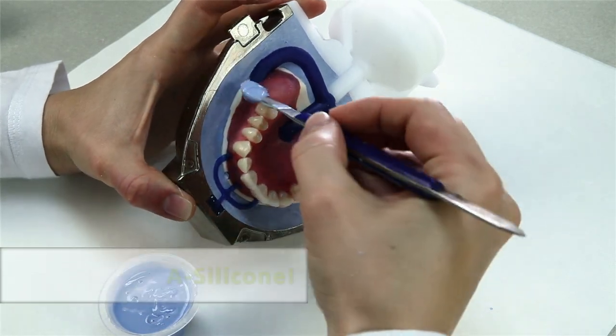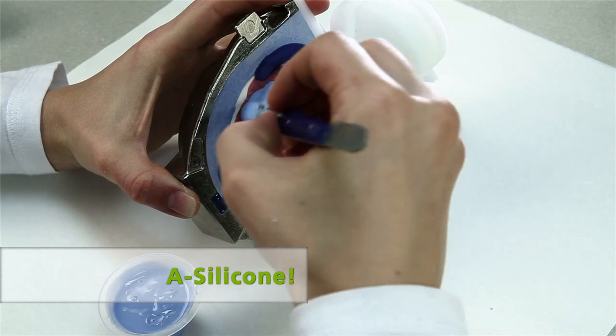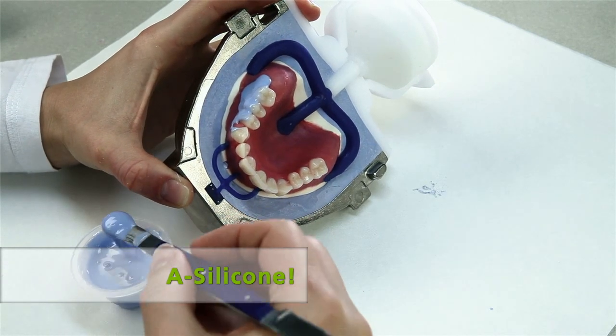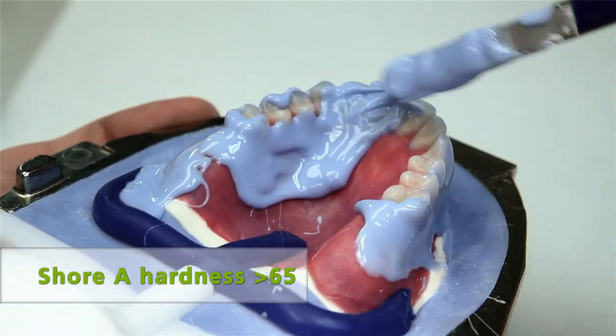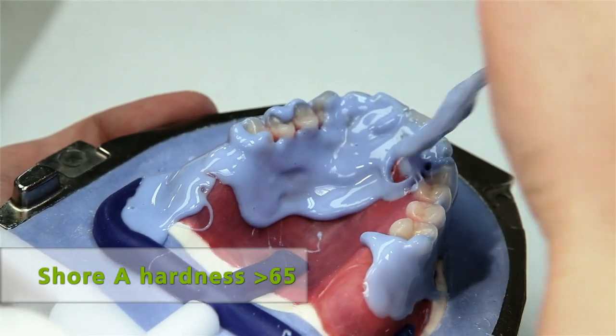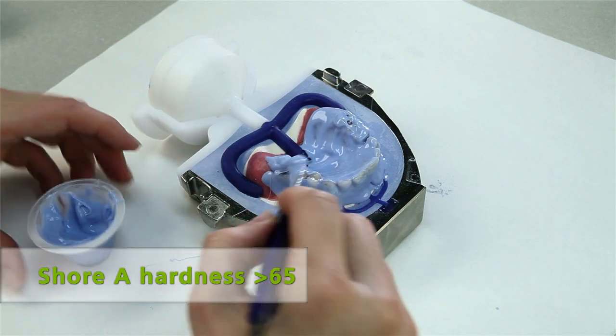Cover the teeth as well as the anatomically contoured alveolar area and the lingual or palatal areas if required with a flowable to medium viscosity addition cross-linking silicone. The Shore A hardness should be at least 65.